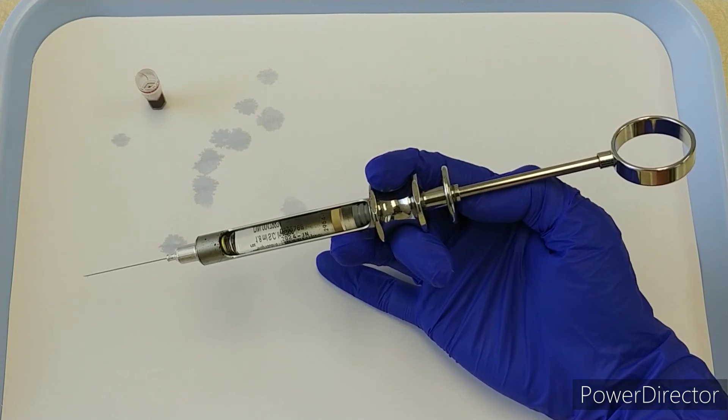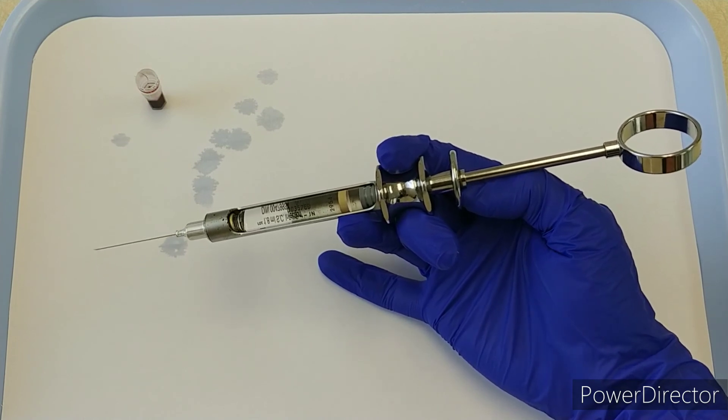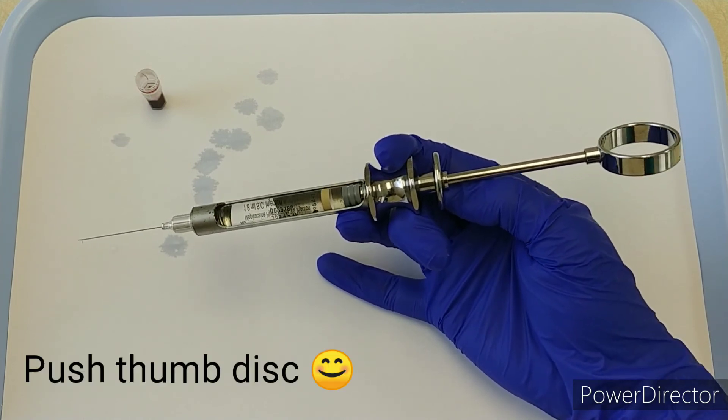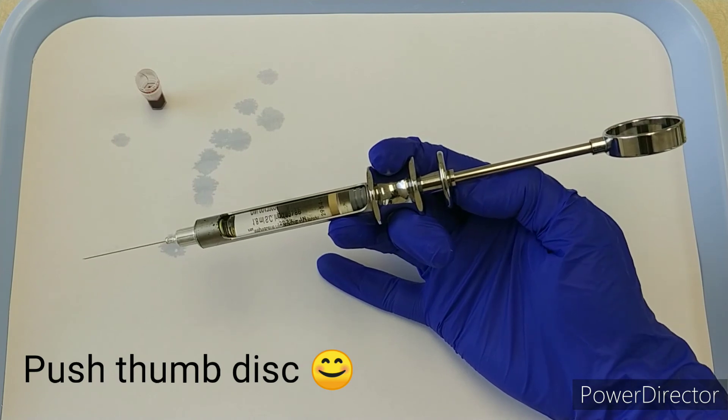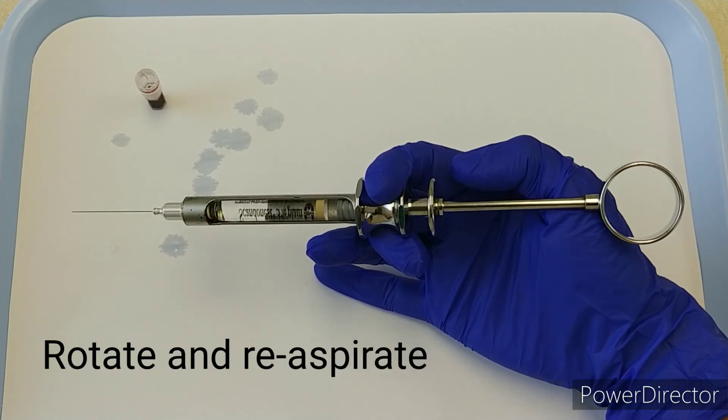To do aspirations with this self-aspirating syringe, I just have to push that thumb disc in pretty hard, and then I'll get my aspiration. Then I'm going to rotate a quarter turn and do it again. You can see the bubbles traveling up.